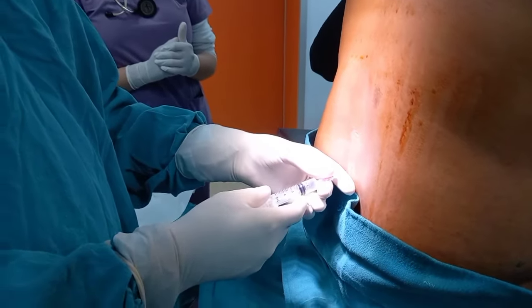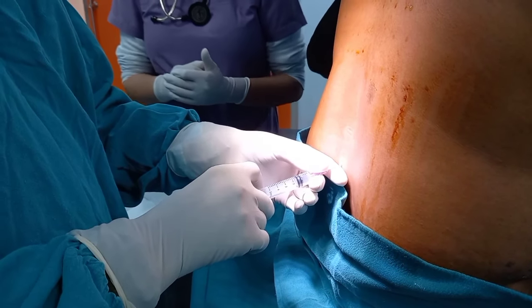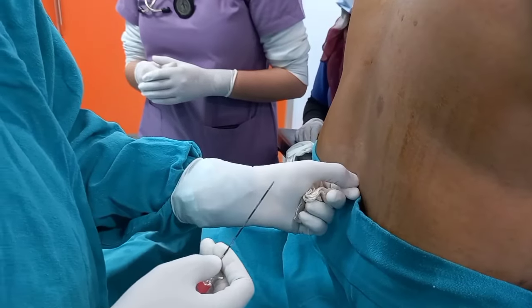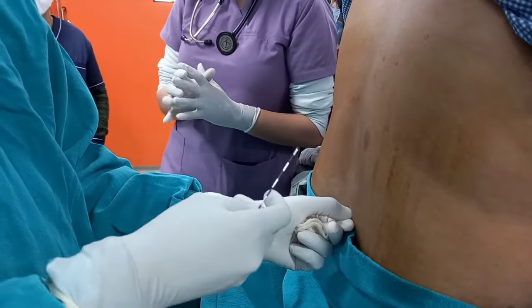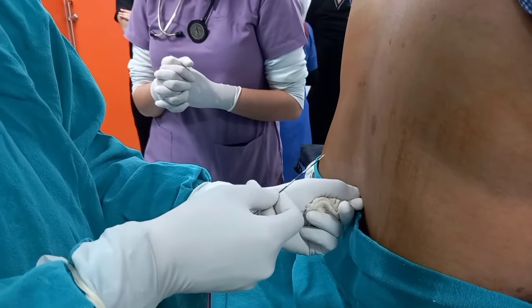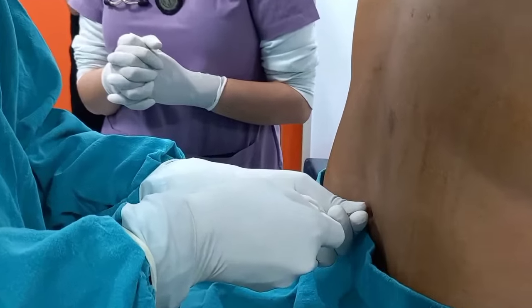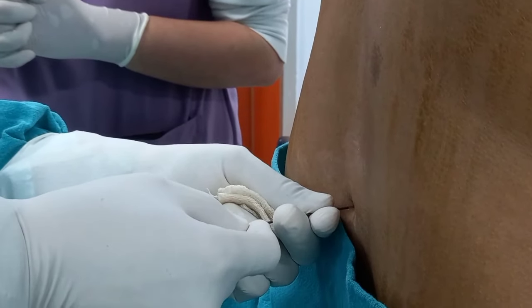Here we are going to explain the epidural catheter placement. At times it is difficult to identify the epidural space even in experienced hands. The common techniques used are loss of resistance with air, loss of resistance with saline, hanging drop method and others. None is having the objectivity of learning. It is difficult to teach the pieces. Here I am going to show the technique of epidural anesthesia by loss of resistance by balloon deflation.